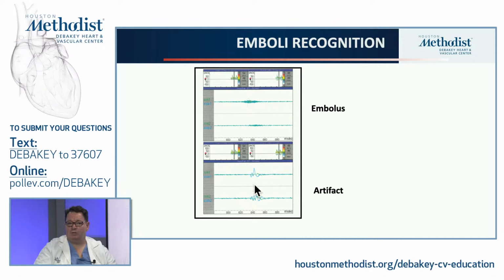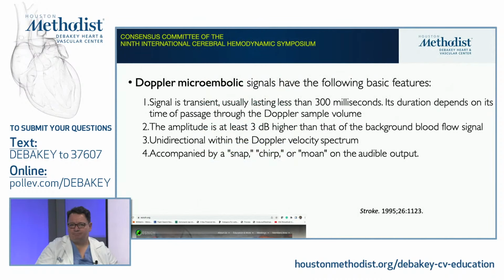Here, this is so unorganized. The waveforms are not moving in the same symmetrical shape, and again, it is just not organized. You see that this is a little bit of a weak signature, and this is when it's sitting on the zero line. So that's how, by multi-depth sampling, you're able to differentiate them.